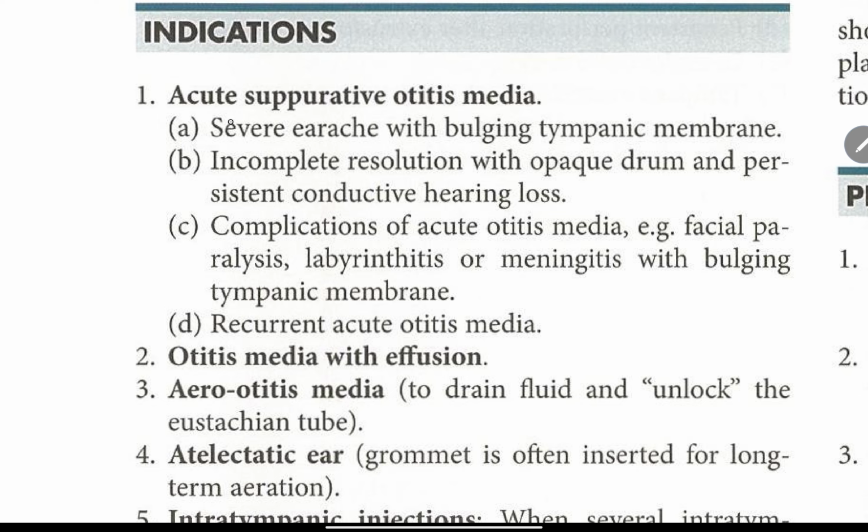Indications. 1. Acute suppurative otitis media. A. Severe ear ache with bulging tympanic membrane. B. Incomplete resolution with opaque eardrum and persistent conductive hearing loss. C. Complications of acute otitis media, for example facial paralysis, labyrinthitis, or meningitis with bulging tympanic membrane. D. Recurrent acute otitis media.